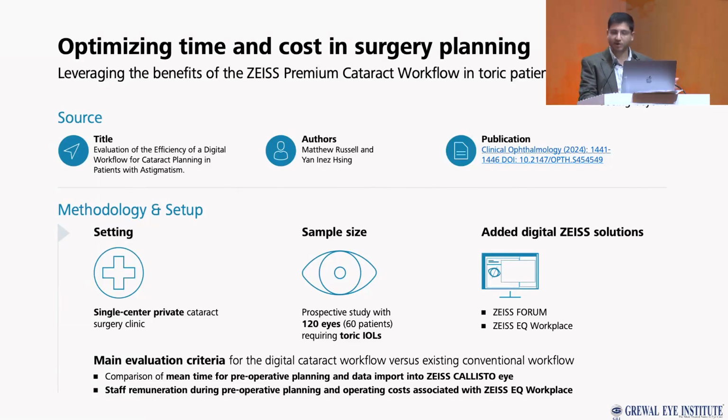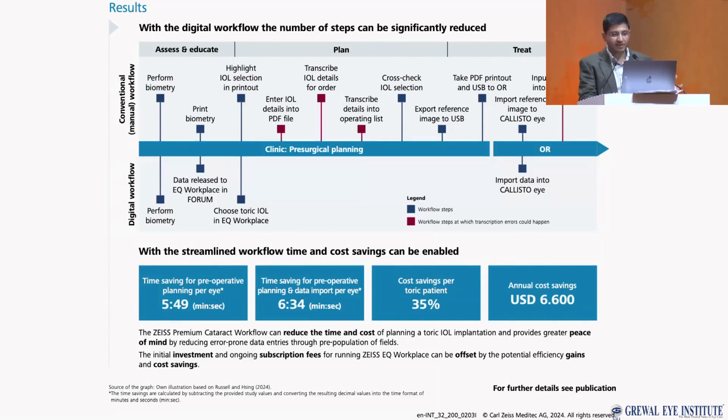eyes undergoing toric IOLs. And they showed that they saved almost 6 minutes per eye in the whole preoperative planning process. And overall, including the whole process of data importing in the OT and all, that even increased to 6.5 minutes.